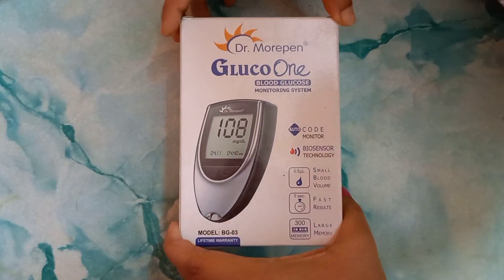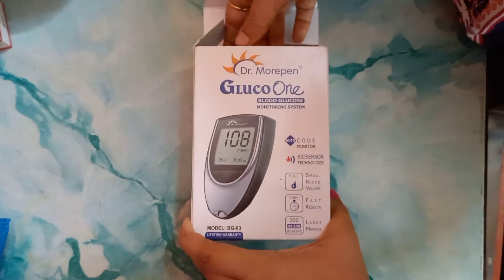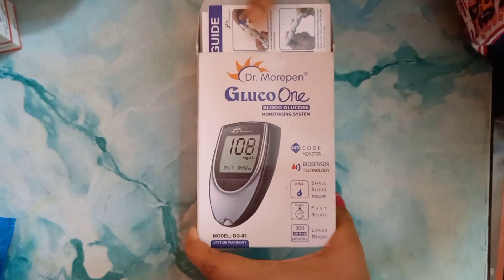Today we are going to show you the Dr. Morpin Gluco 1 blood glucose monitoring system. Its model number is BG03.